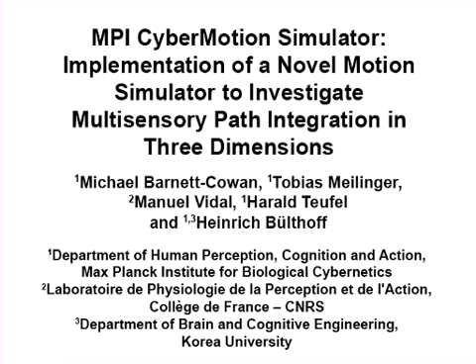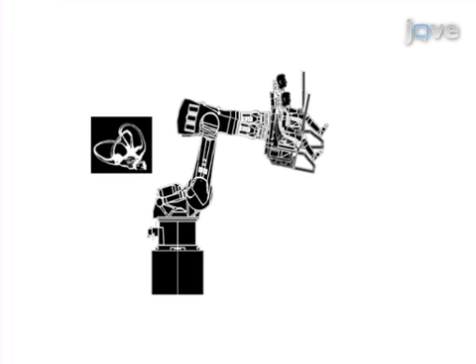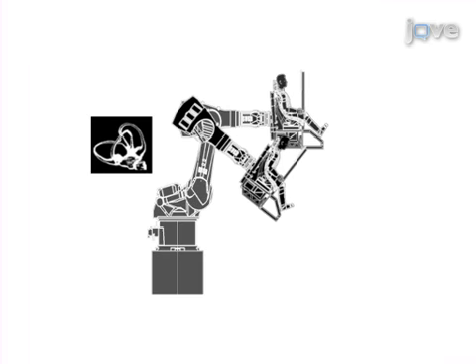The overall goal of the following experiment is to measure path navigation in 3 dimensions while controlling visual and vestibular sensory input to the participant. This is accomplished using a modified robotic chair with 6 degrees of freedom that stimulates the vestibular system.